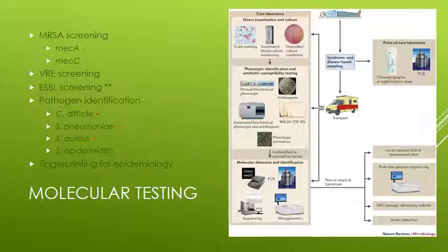Wound infections, toxic shock syndrome, scalding, so all those things are ideal. We also, you may think, why do we care about Staph epidermidis? Well, if we can identify an organism as epidermidis really quickly, then the doctor might be able to say, oh, well, it's just contamination. I don't need to worry about it. And a lot of that pathogen identification, in particular from blood cultures, is very highly useful with MALDI-TOF, as you know, and we'll get into that.